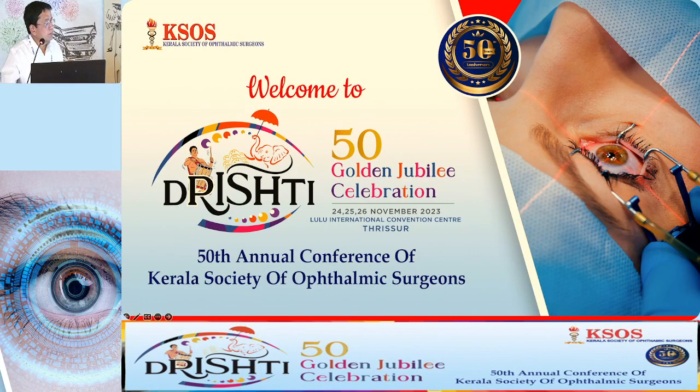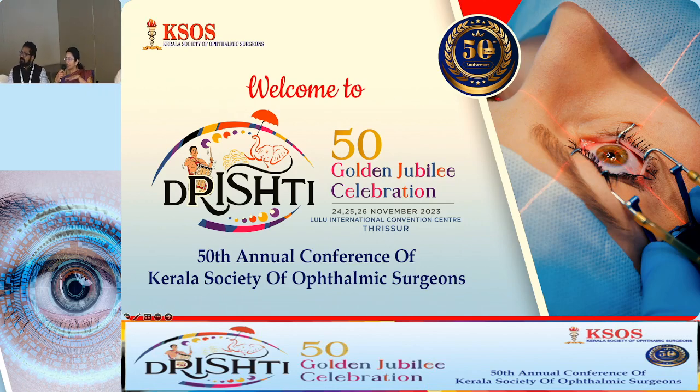Thank you so much, sir. I have one doubt. In the third case you showed, there was a thick fibrotic plaque under the capsule. So could the femto complete a cut through that plaque?